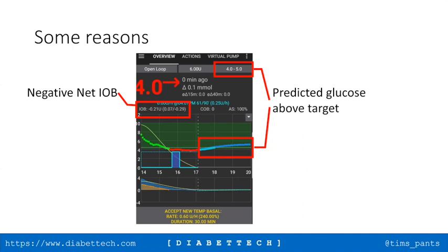So, where do you run your target at? 5.5 to 6. So I would initially run your target higher, because if you're being pushed down to hypo quite regularly to the levels that it's causing you to fit at, it would suggest that there's a setting that's out of line somewhere. And the best thing to do to manage that in the meantime is to run at a slightly higher target.